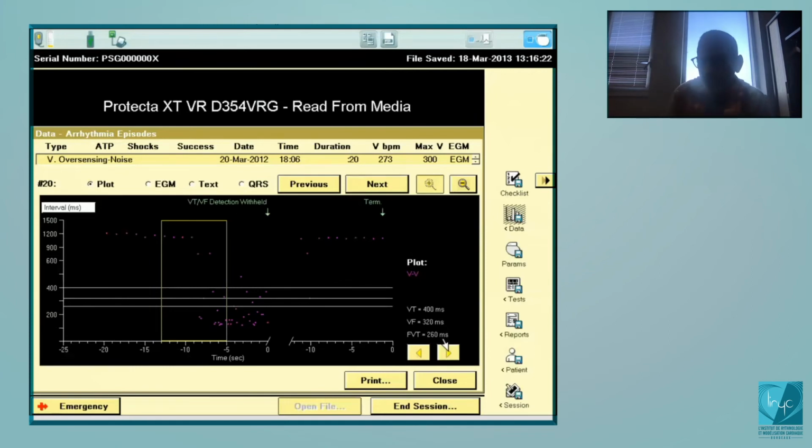And if you have a look, in the cases of lead dysfunction, most of the time the 2 parameters are the short cycles and the non-sustained VT, not the impedance. If you base all your strategy for preventing inappropriate shocks with remote monitoring on only the measurements of the impedance, you will have quite a late diagnosis. The short cycles and the non-sustainability, not in all but in most patients, are encountered before the problems of impedance. And if you see these 2 out of 3, you will not inhibit the therapy. You will just delay the therapy.